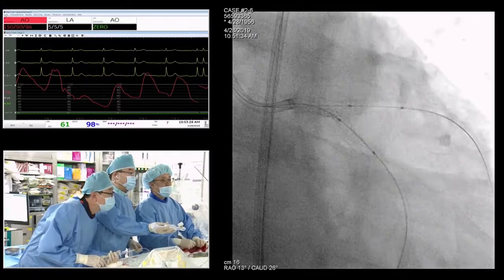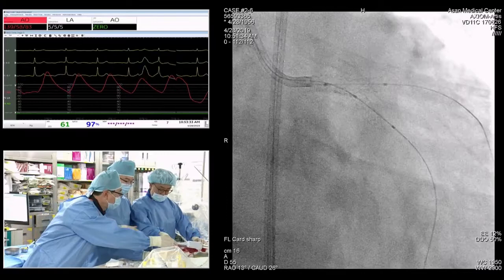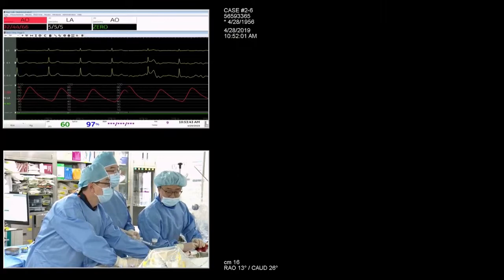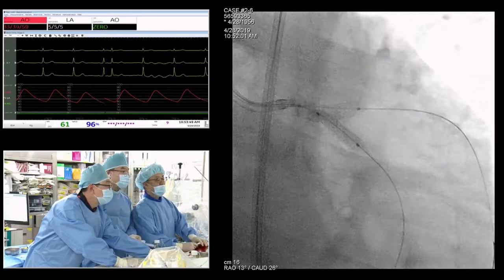This is the final step. Okay, a little pullback up there. Okay, the back is a good fit. Let's go with the kissing balloon first. Go. 6, 8, 10, 12. Okay. Save. Deflate. Pull back one more time.